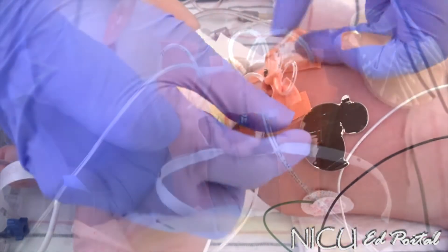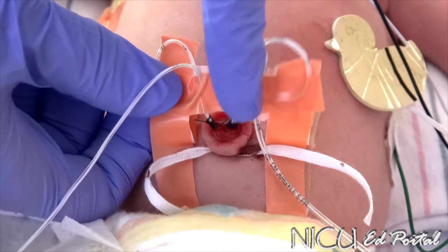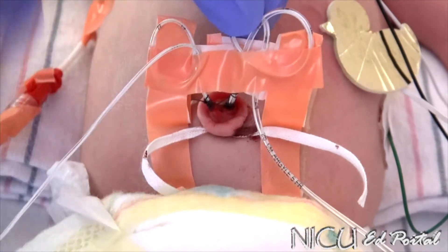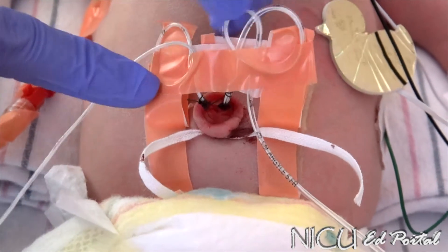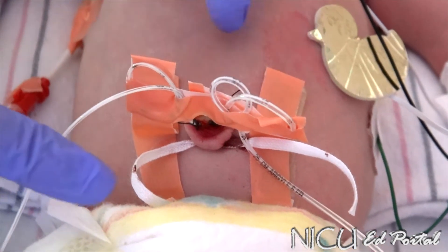There's a complete divide between the arterial and the venous, and the arterial usually will come out first anyway. That way you're able to distinguish them, and by doing this you can also see your numbers and it does have the air cushion.